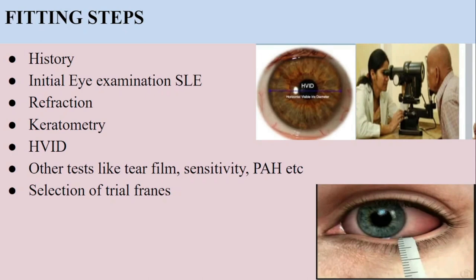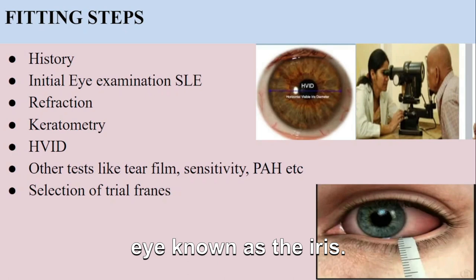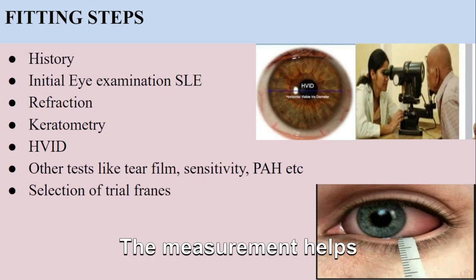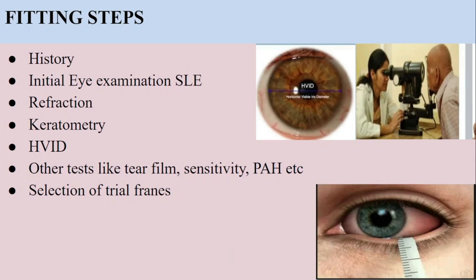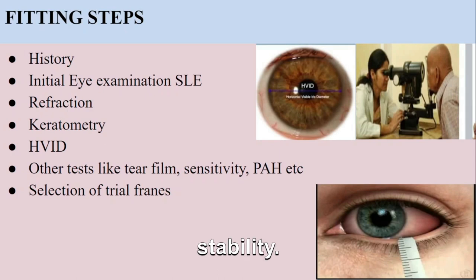Number five, HVID, which stands for horizontal visible iris diameter. It is a measurement of the visible portion of the colored part of your eye, known as the iris. The measurement helps in the selection of the right diameter and design of the contact lens to match the size of your iris and provide optimal coverage and stability.